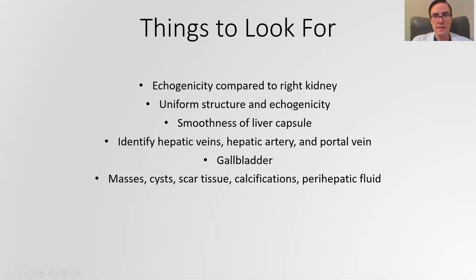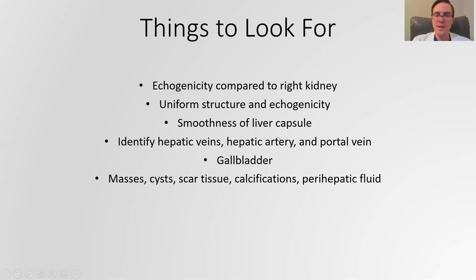If uniformity is not the case, it can indicate a fatty liver or cirrhosis. You also want to look at the smoothness of the liver capsule — it should be nice and smooth, and if it's not that can indicate underlying distortions in liver architecture that can happen with scarring. Then you want to look at the liver vasculature, including the hepatic veins, arteries, and the portal vein, and be able to distinguish those and take measurements of their characteristics. You should always look at the gallbladder for abnormalities, and on a broader scale you're looking for any major masses, cysts, scar tissue, calcifications, or large effusions anywhere around the liver.